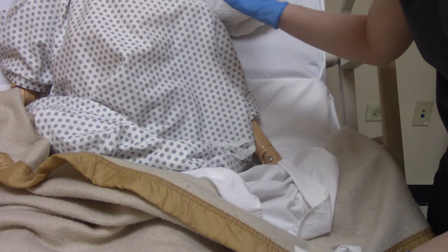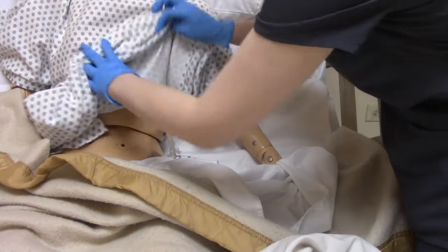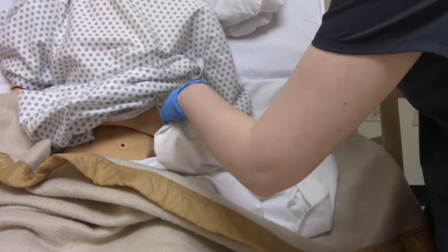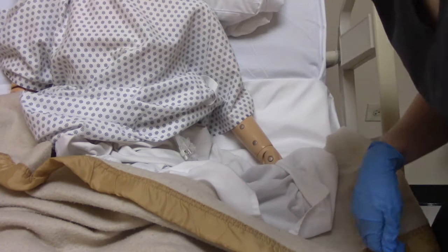To prepare the patient, you want them sitting up in a semi-Fowler's or high Fowler's position. Then grab a towel and place it underneath the G-tube area in case there's any drainage or leakage, so you don't get it on their clothes or their bed.